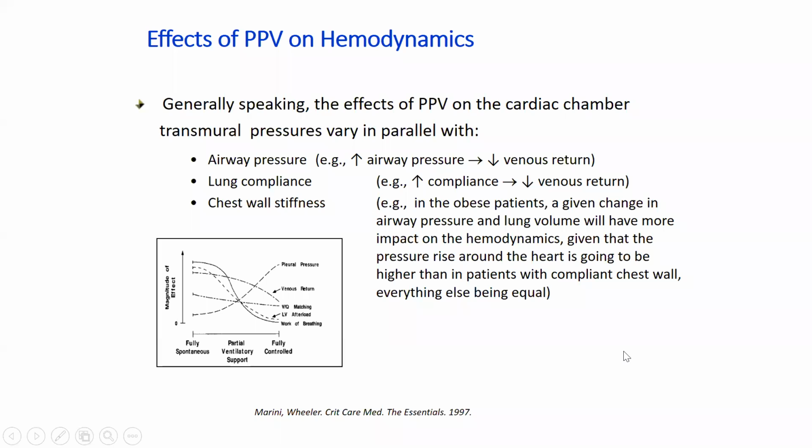I had a quick question. Can you hear me okay? Absolutely. Okay. So sometimes when patients are breathing on their own and trigger their breath, they'll breathe at closer to 10 mLs per kilo or 12 mLs per kilo, despite the ventilator being set at 6 mL per kilo. I've seen sometimes when we're closer to extubation that we increase the tidal volume to match closer to where they are. My understanding is that it's to decrease their work of breathing. And I guess my question is, is that okay if you're closer to extubation versus closer to paralysis for more lung protection? Or, not paralysis, sorry, sedation.